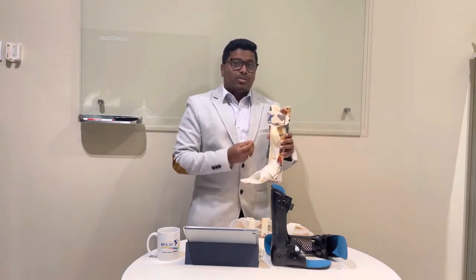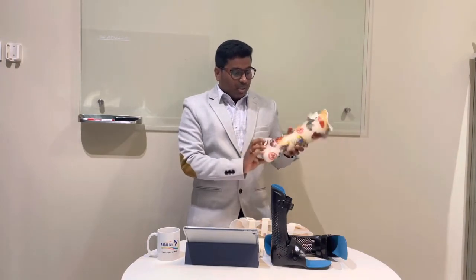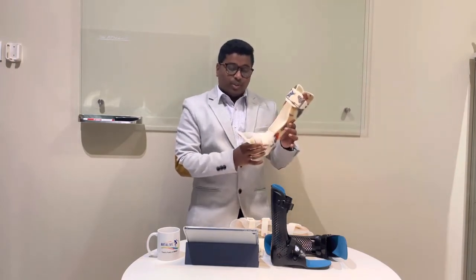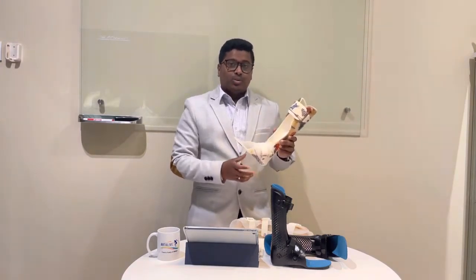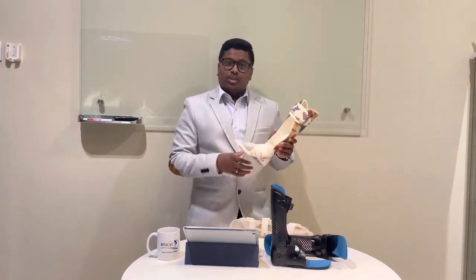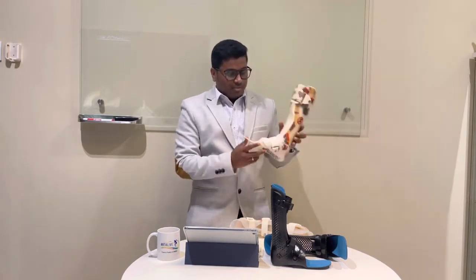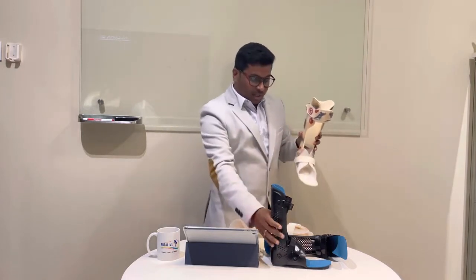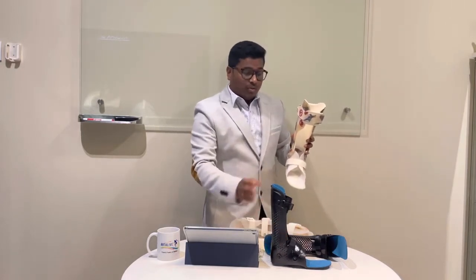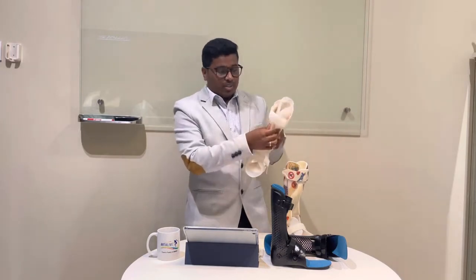The child feels discomfort using the AFO for longer periods, and parents also feel stressed because of this. With the double wall AFO, it becomes quite bulky, and parents need to search for bigger shoes for their children for school as well as for normal activities. Compared to other AFOs, the double wall type is heavier and bulkier.